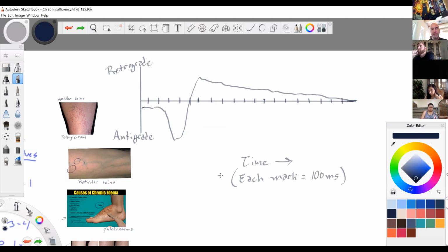With the patient standing, and if you have an automatic cuff, which I was never given, which sure as heck would have been nicer. An automatic cuff is one that squeezes quickly, holds for a second, and then releases. So obviously you want blood moving up quickly, and then you need to release to see what happens next. The waveform is going to be similar for all of them, although there's going to be different times involved. So let's look at this waveform that I have on the screen.